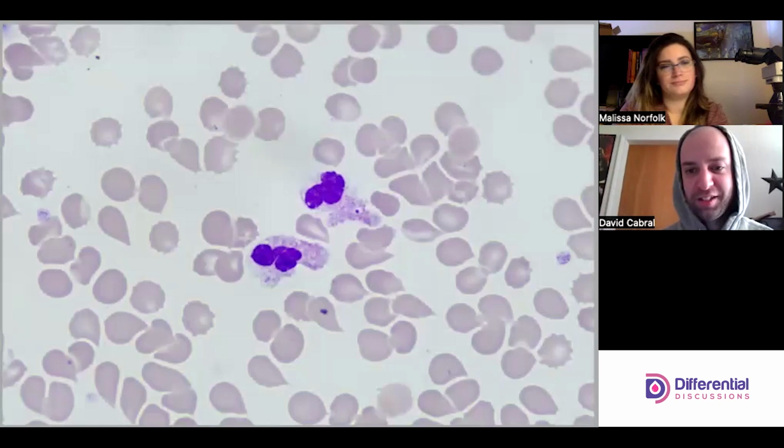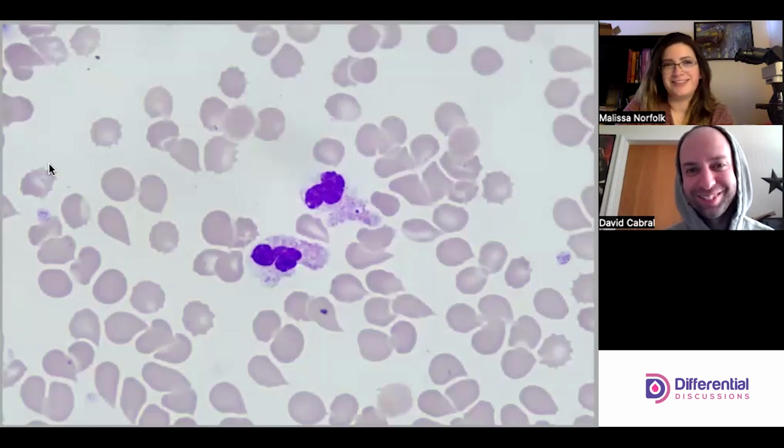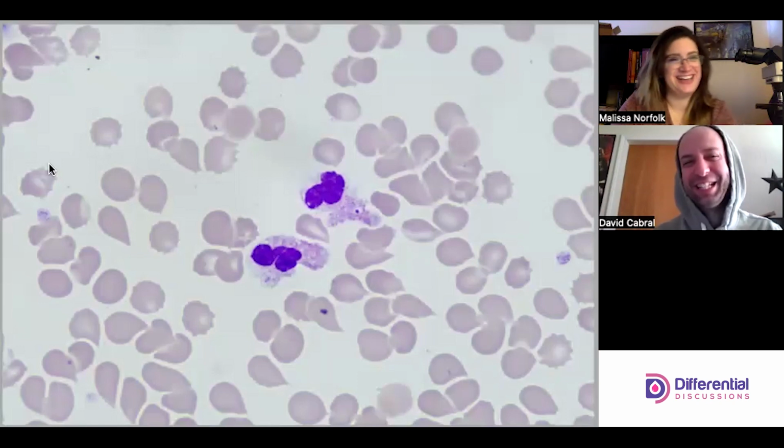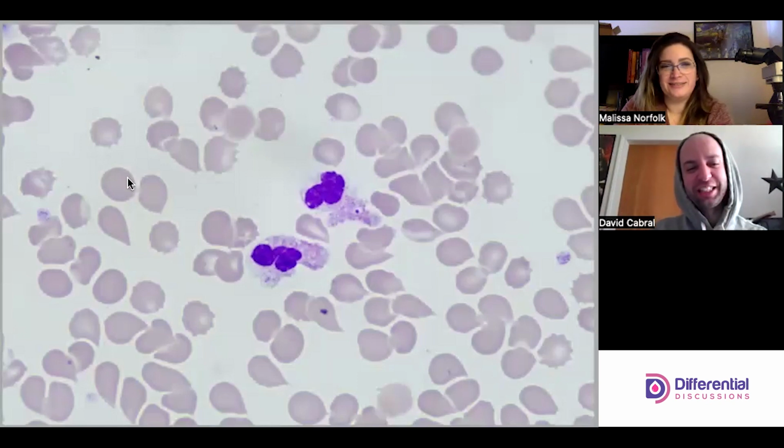But yeah, I think a lot of what you're going to find on this is that the area we're in looks crappy. It's because all the areas are crappy. I feel like we've been saying that a lot lately, that there's a lot of really sick patients. Yeah, I think it's just reflective of the status of the patient more than anything.